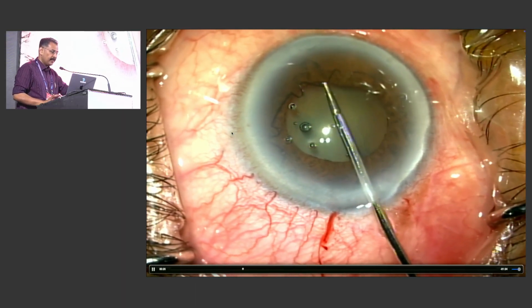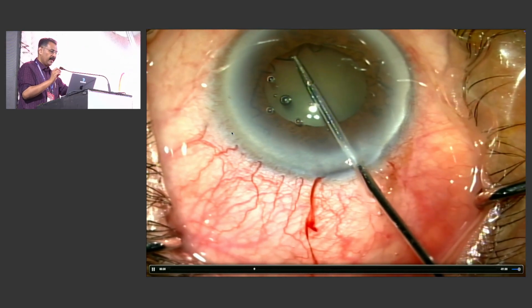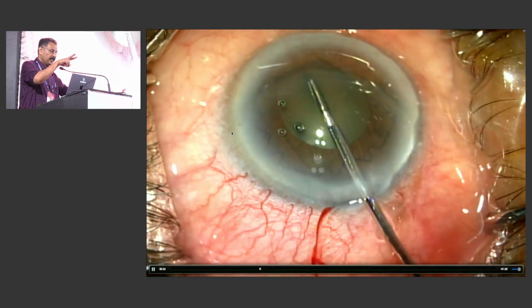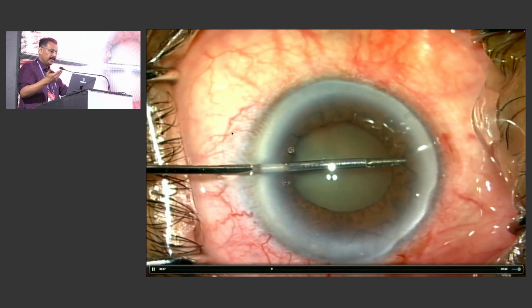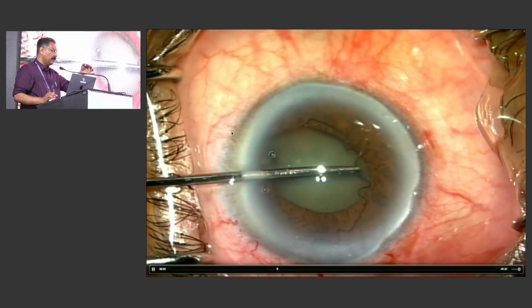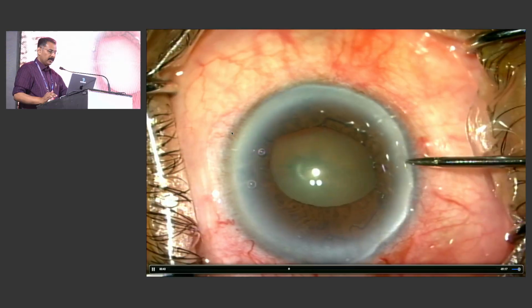And these round circles which are there help you to hold the flange. And these 2 finger-like projections easily go underneath. Use 2 paracenteses and then go from either side. Holding it vertically or at 180 degree opposite angle is very useful. You can easily place it.